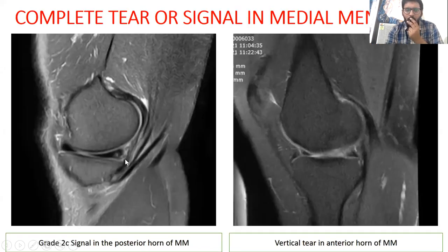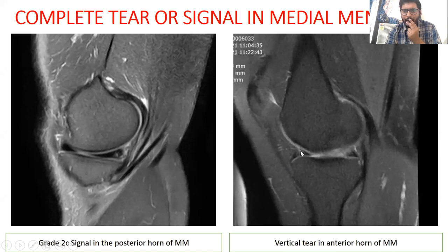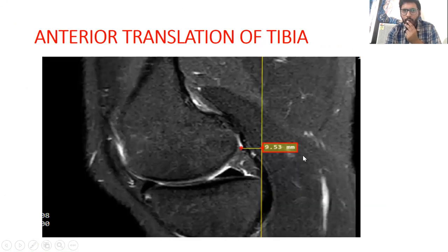A complete tear of the medial meniscus is when the signal intensity reaches one of its articular surfaces. This is a grade 2C signal in the posterior horn of the medial meniscus, and this is a vertical tear in the anterior horn of the medial meniscus.